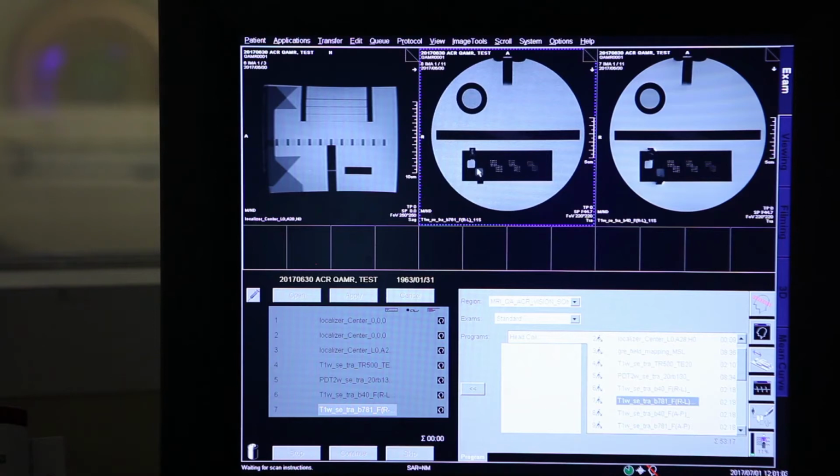Yes, exactly what we're expecting. The fat shift is less than 1 millimeter. So this is the real structure, and this is the best you can have as far as the MRI is concerned. You have fat depicting fat and water. That's the best technique you can have on this machine. And we have also eliminated the artifact of the susceptibility at the edges.